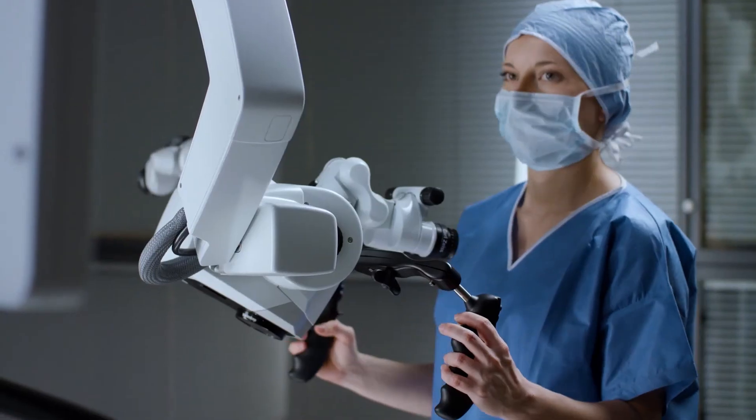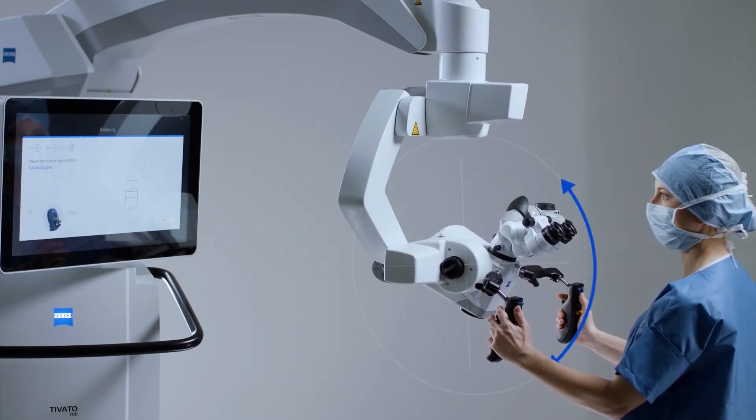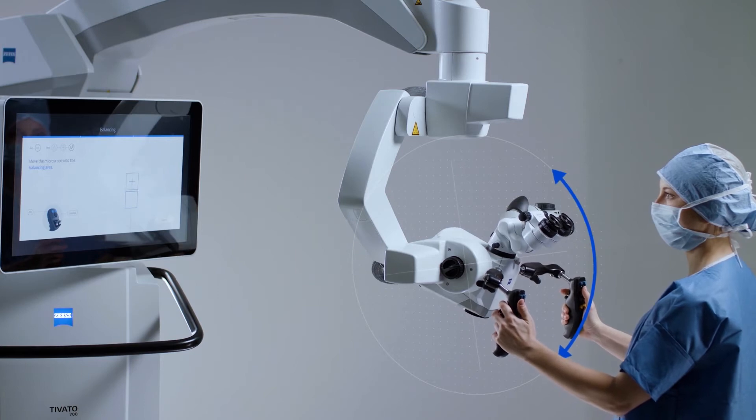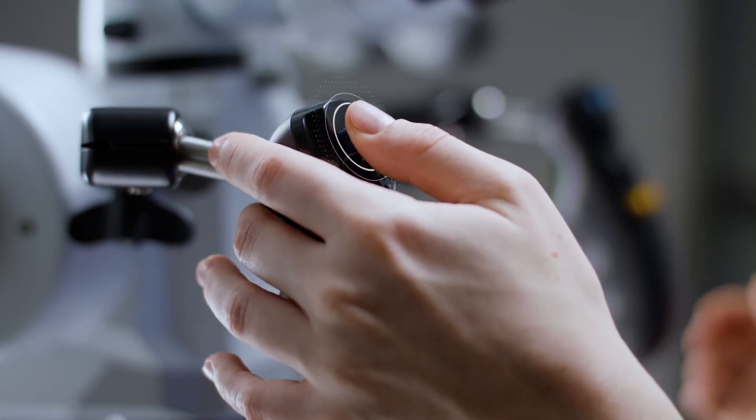Always hold the hand grips with both hands to stabilize sudden movements. Start the workflow by pressing the brake button on the back of the handgrip. Move the system into the balancing area where both crosses align and turn green. Confirm with the OK button.